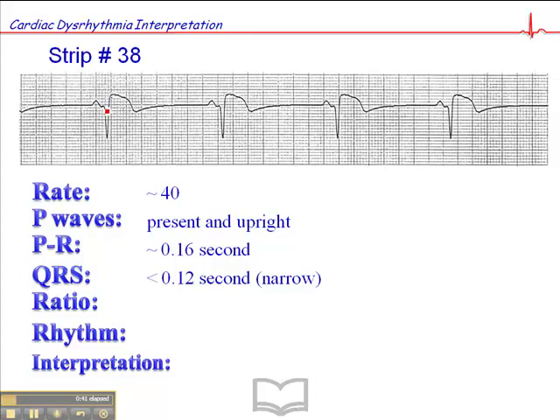Now you notice that here's the baseline and here's the J-point. So the ST segment is elevated above the baseline, and it's got this kind of weird asymmetrically inverted T-wave. But again, T-wave doesn't play a role in rhythm interpretation. Just keep that in mind.